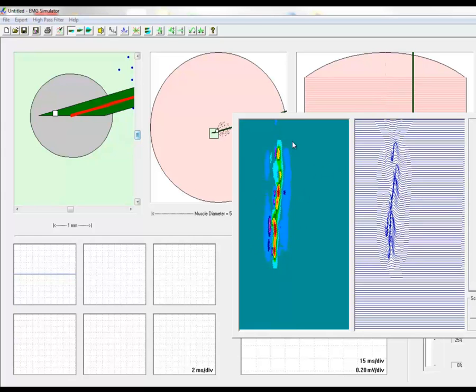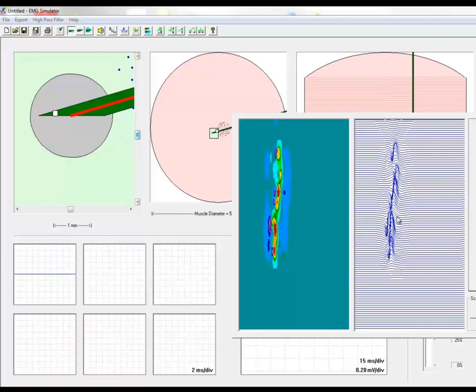To the left we have the amplitudes transformed into colors. Normally we do the EMG either here or here or here and obtain different motor unit potentials from the same motor unit.